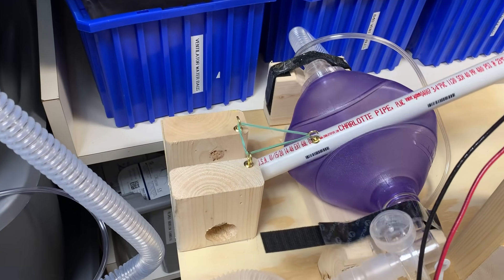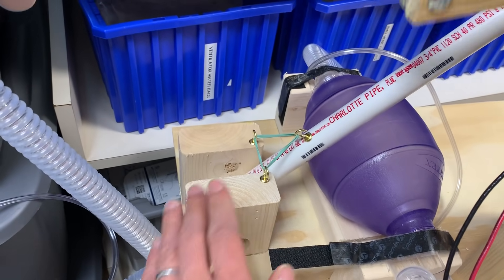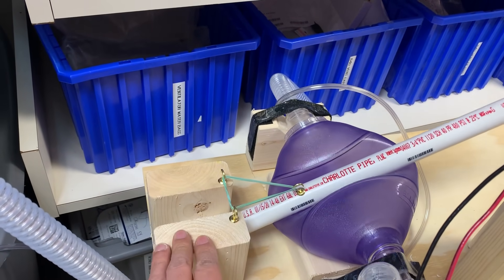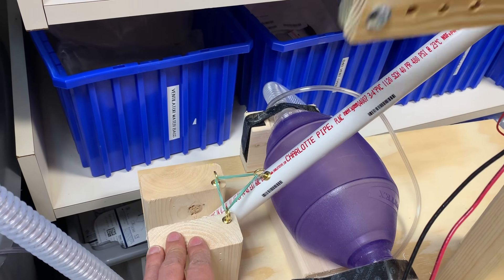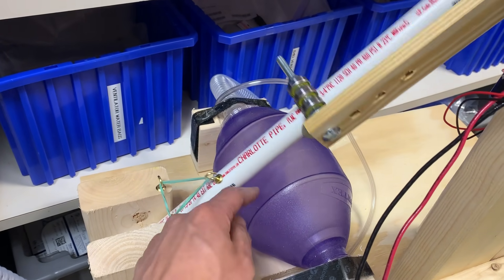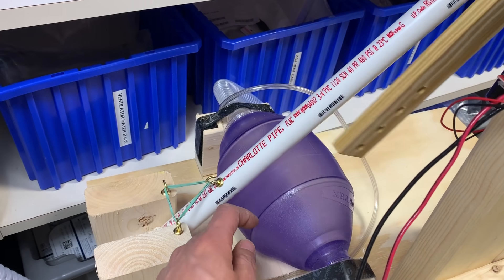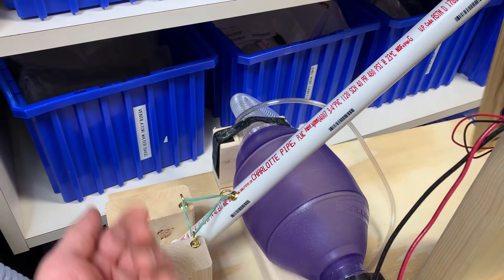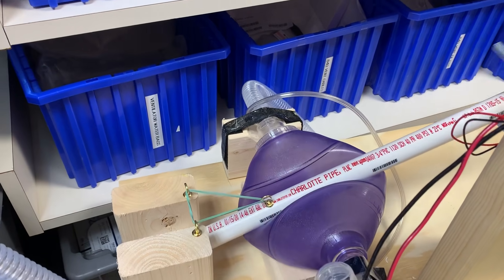Over here on this end, the large part is the same. I've just added this little rubber band system to help return the compression arm up to position between breaths. Over time, the bag gets a little less elastic and doesn't spring up as well, and so this just helps bring it up to position so you can maximize your tidal volume as you press down.